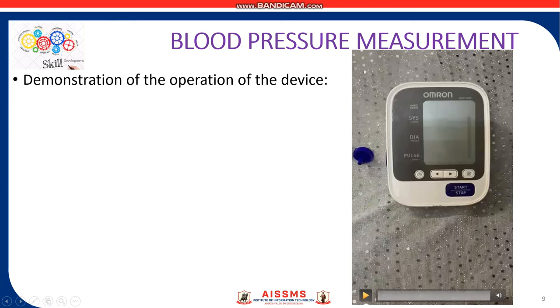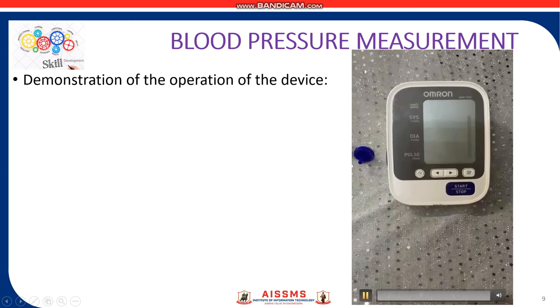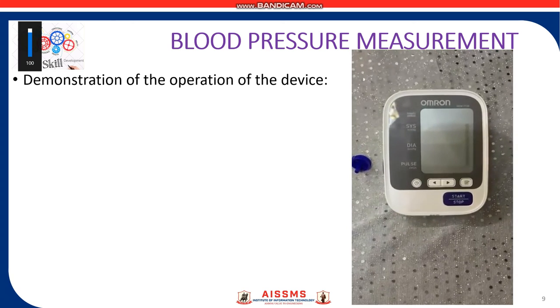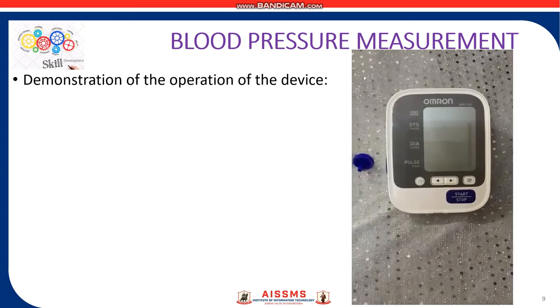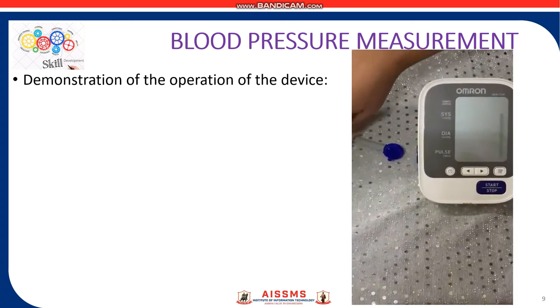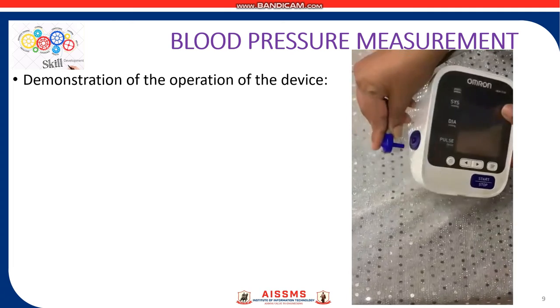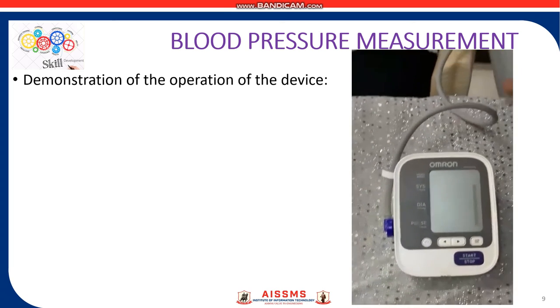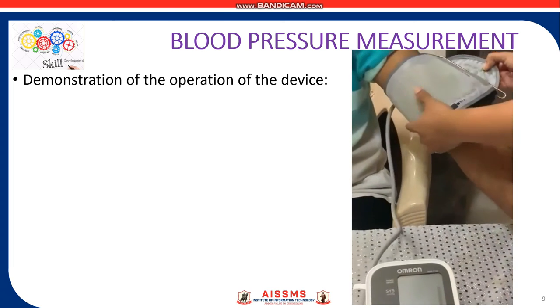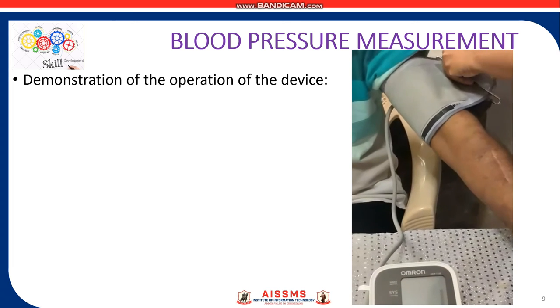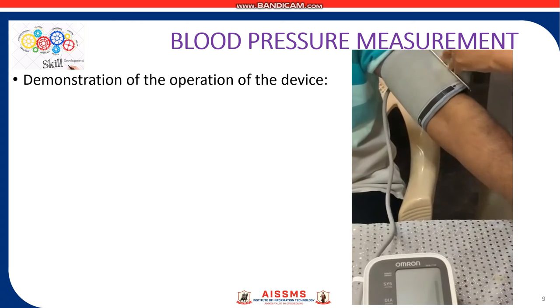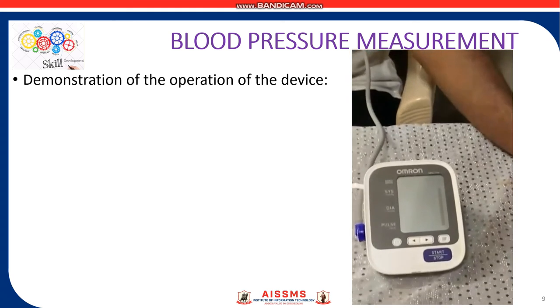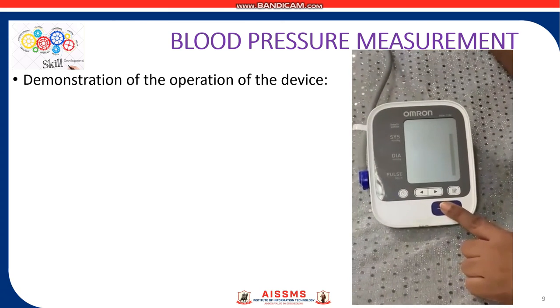Let us now see the demonstration of the operation of the device. The first step for monitoring blood pressure using the automatic blood pressure monitor is to insert the air plug into the air jack securely. Step two is to put your arm through the cuff loop. Step three is to close the fabric and fasten firmly. The next step is to press the start/stop button.